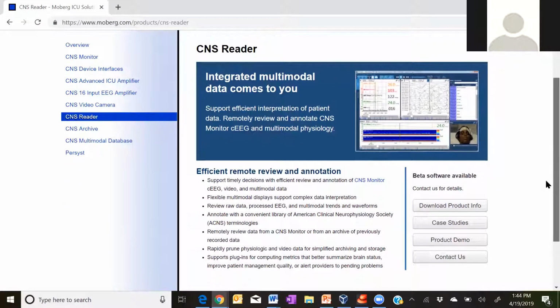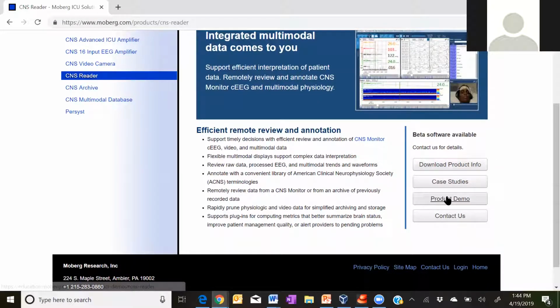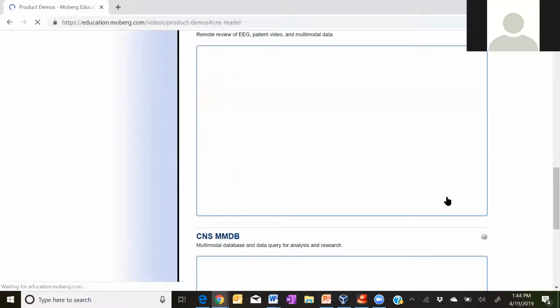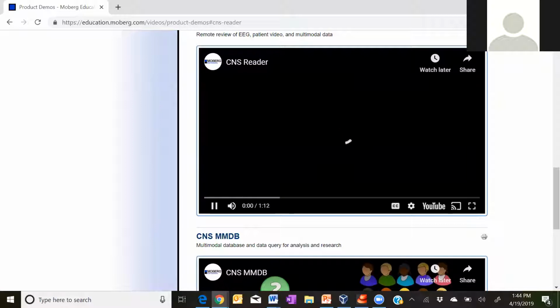And I believe I was able earlier to find a little video. So let me see if I can pull that up for you guys to see. I'm going to do product demo. And hopefully this will come up. Yeah. So let's take a look at this.